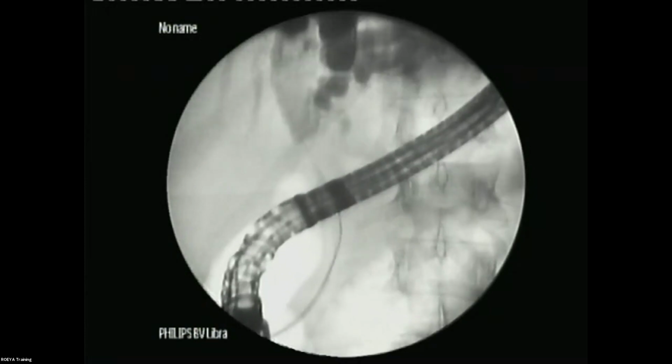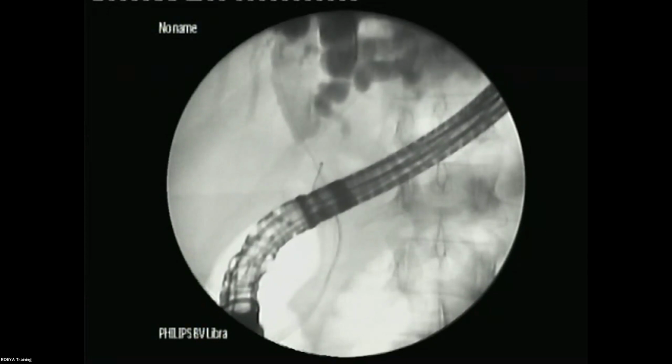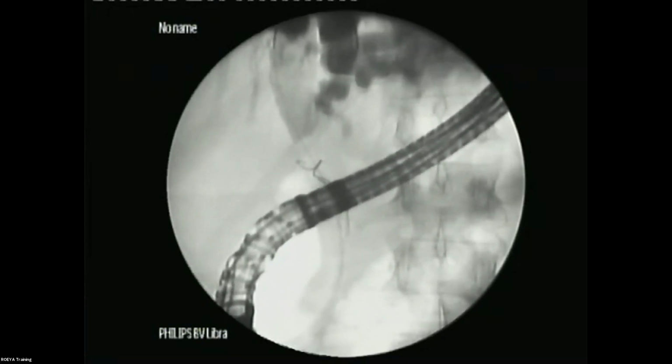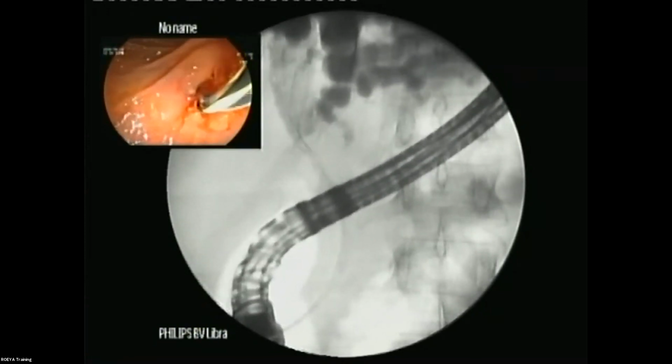Yes, please, if it's possible, if you look at the MRCP presented by Noran, you find that it is already not a hilar tumor. If you look at the MRCP, the origin of the right duct is coming just at this side of the structure, as this side. Yes, this is true.